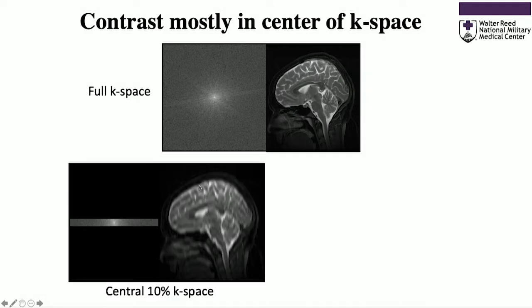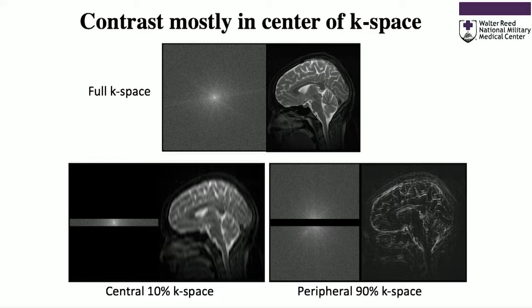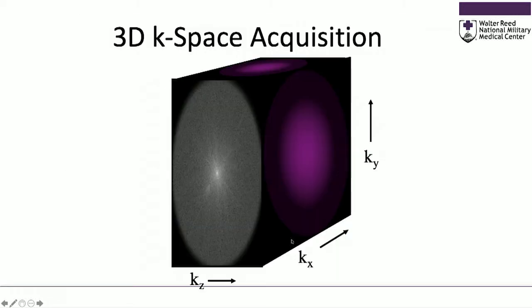As we talked about, only the center 10% of K-space is where the information about the signal intensity at each point exists. As Chuck told us this morning, there's a 1-to-1 correlation between the K-space and our final image domain image. And the 90% of K-space is where the edge or resolution information exists.